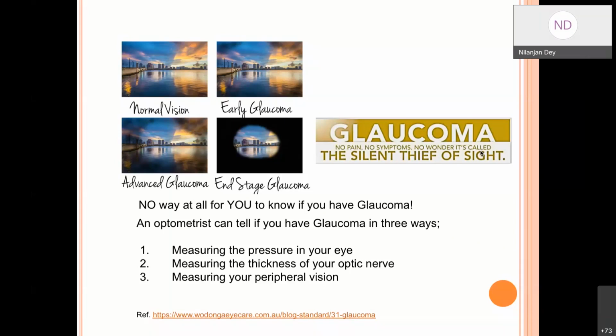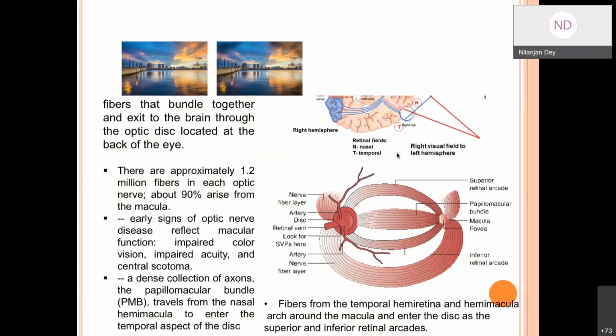How does it actually work? If you look at the front side, you will see there is an optical cup and an optical disc. These measures are called the superior, nasal, inferior, and temporal. And this is called the neuroretinal rim. Now, this is the cup and the disc. In between, there is the optical cup to disc ratio. It should not cross 0.58. If it is above 0.58, it's a clear case of glaucoma. So that's why we need to study the cup to disc ratio.